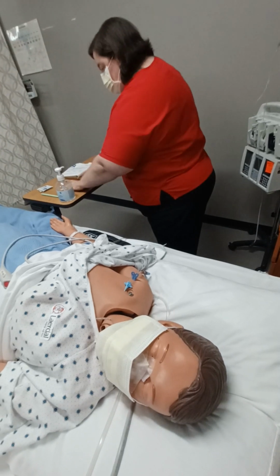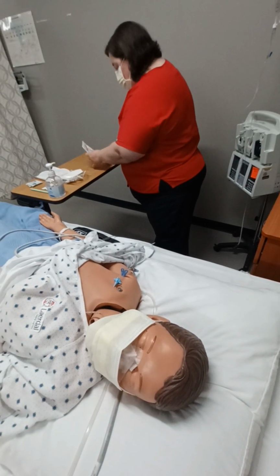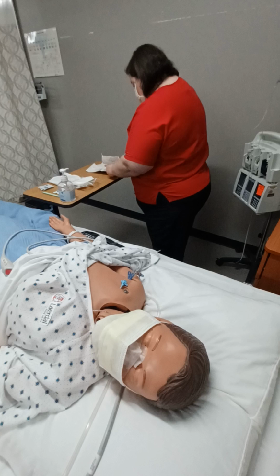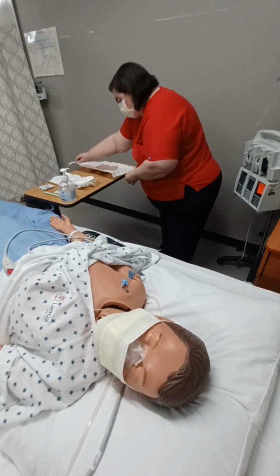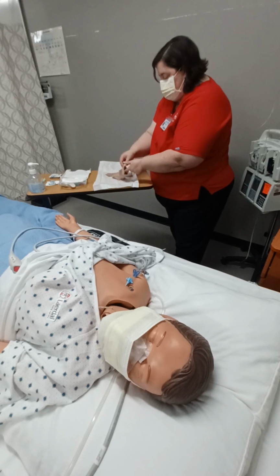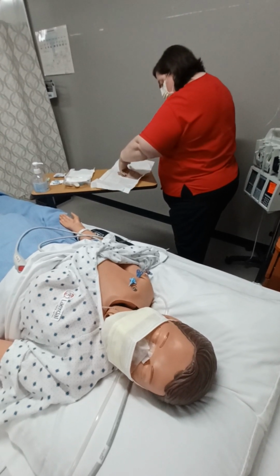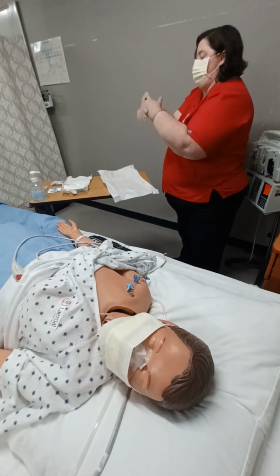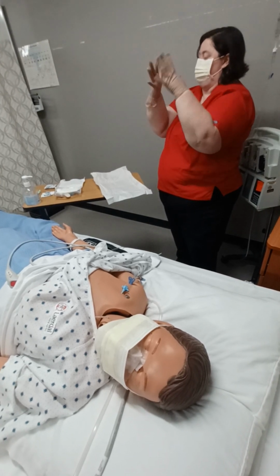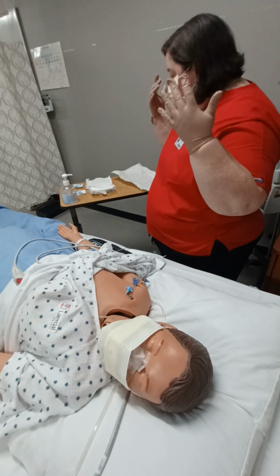All right. I'm going to open my sterile kit and also my sterile gloves, so we don't overlap sterile fields here. Dominant hand first. Dominant hand. Oh, we're going to pretend like that didn't happen because my hand is still covered. Okay, don't want to touch my sterile fields. I'm going to use my foot. Keep my hands up above.